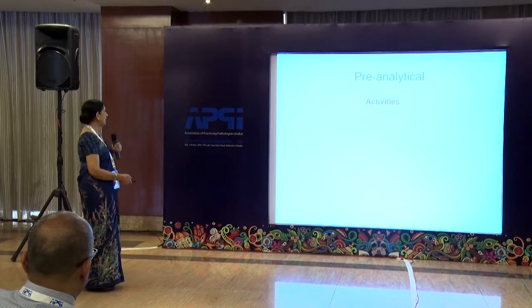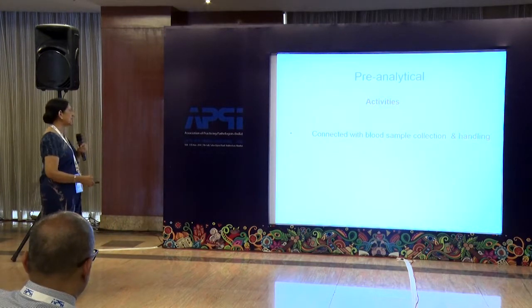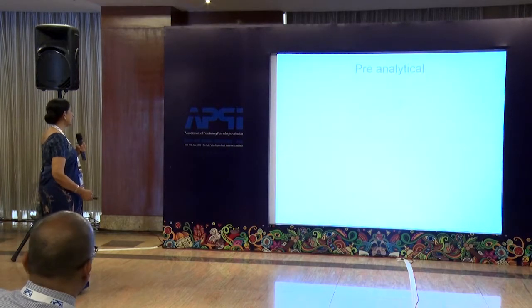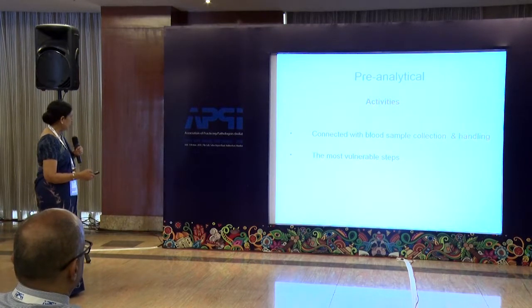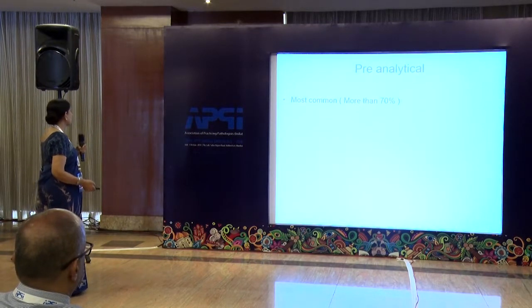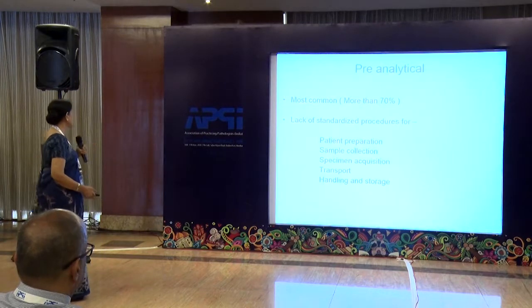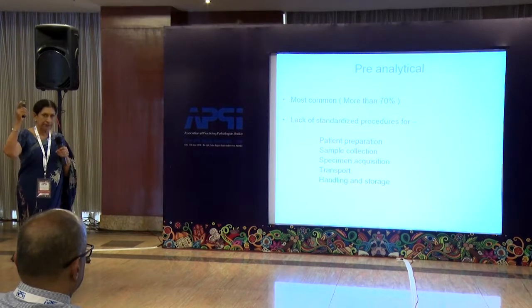What are the pre-analytical issues? There are certain activities which are connected with blood sample collection and handling. That is the pre-analytical phase. These are the most common; 70% of errors happen here, along with lack of standardized procedure for patient preparation.